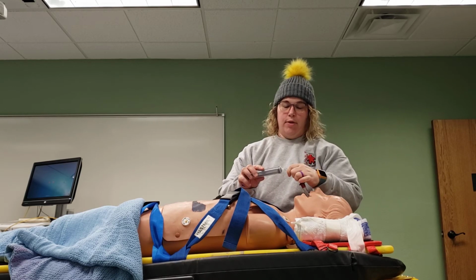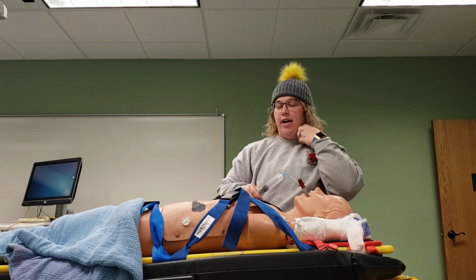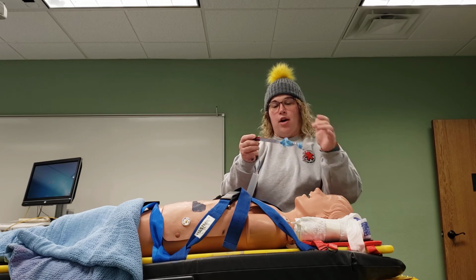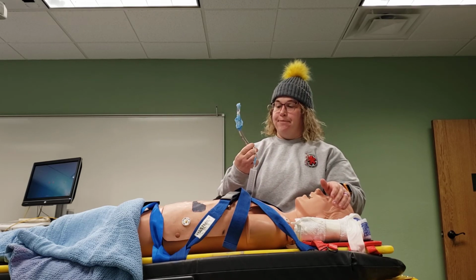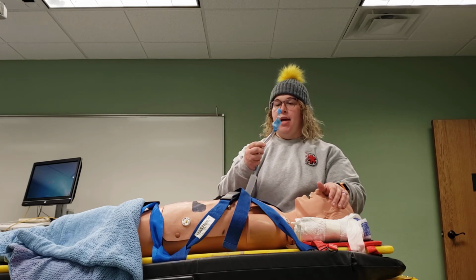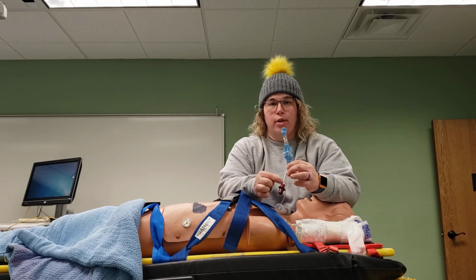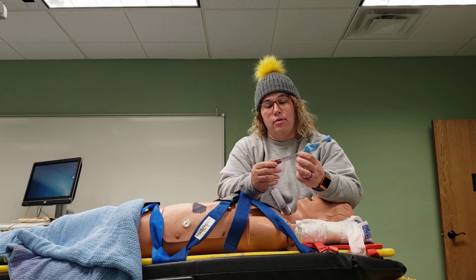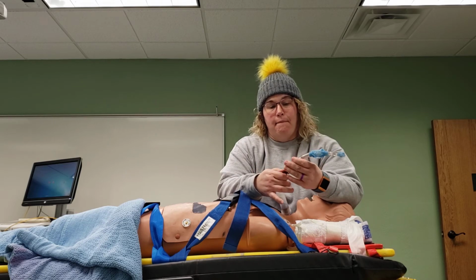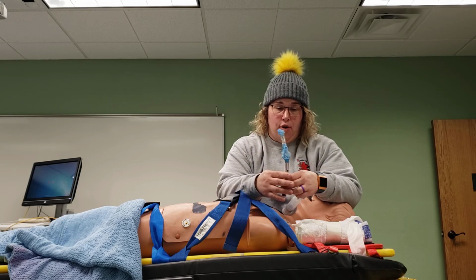The King airways specifically are measured by height. LMAs are measured by weight, so you kind of provide a guess for that. The size 4 King is between 5 and 6 feet, so generally most of our patients are that. Some King airways will have an extra port where you can put suction down with a flexible suction tubing and suction while you ventilate. This one does not. Some of your LMAs may have that too, but that will just help with the overall stomach contents regurgitating.